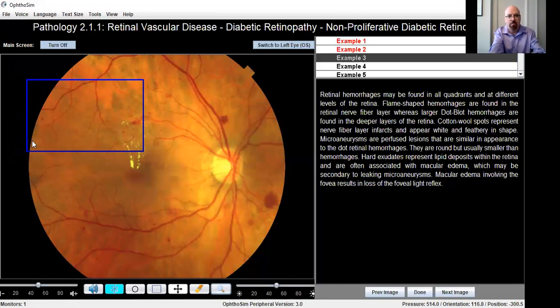You notice that the blue box stays frozen in its last position, and so we don't get any jitter with that, and we can focus on the rest of the fundus view. The other thing that you can do, and I would encourage you to optimize this on a slide-by-slide basis, is just use the light scaler here. So we could either darken the image or make it lighter so that the group viewing it has a better chance to see some of the finer detail and definition of each individual slide.